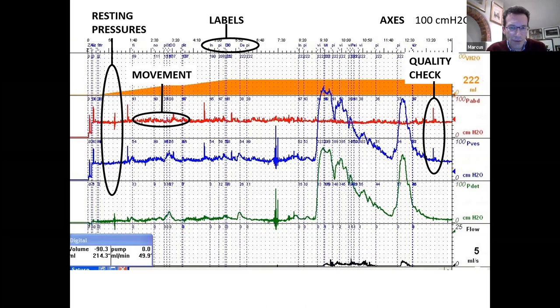Now, when you look at a filling cystometry, you are expecting to see labels to indicate when sensations arose and when provocation tests were done and events that happened. And the particularly important one is when you reach cystometric capacity, and even more important, the permission to void. And those key indicators are not given in this test. Now, why is that problematic? It's incredibly important because we need to decide what is going on when we see flow.